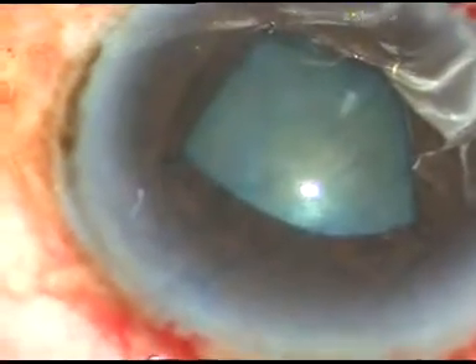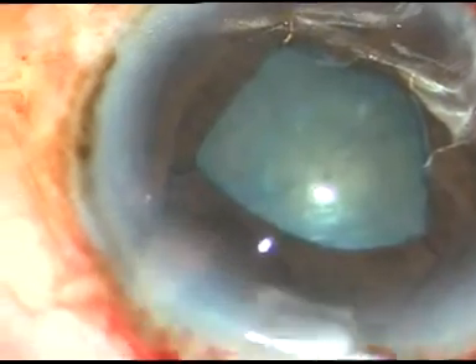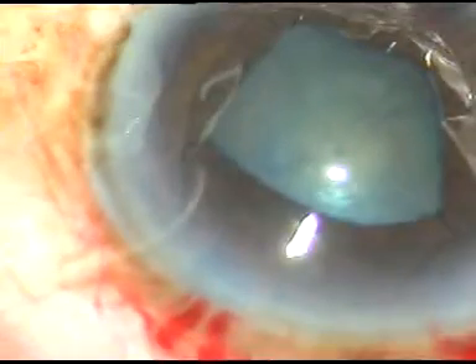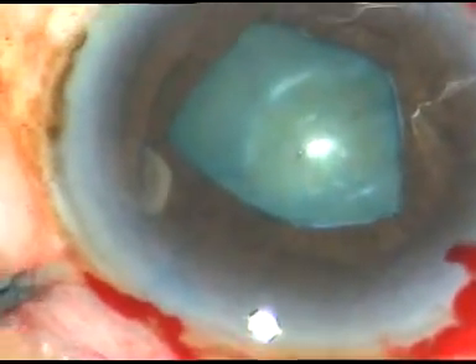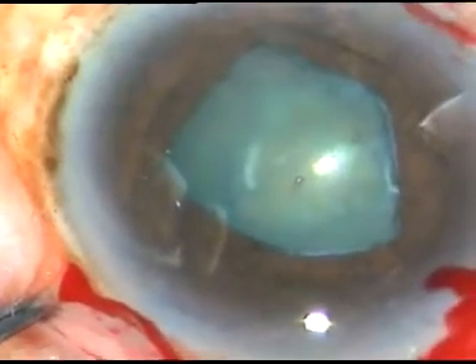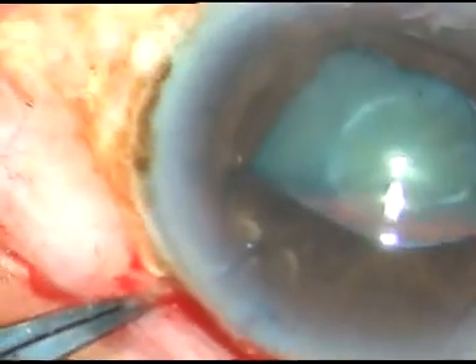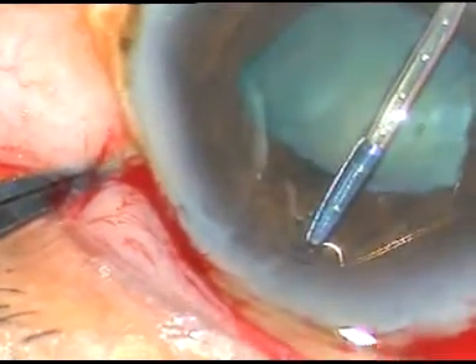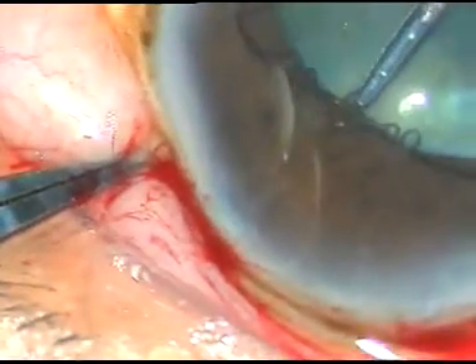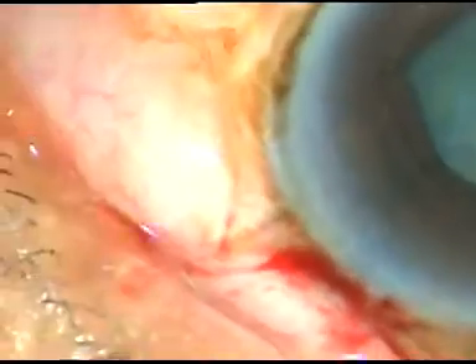How to tuck this flange? Since the patient has a protruding nose and the flange is at 1 o'clock, I asked for the stab knife and I am making a stab incision at 7 o'clock so that I can avoid the nose and go from diagonally opposite. A very small stab incision here at 7 o'clock. Now I use the forceps — easily I can reach there. I hold the middle hole and very nicely I could tuck this flange.